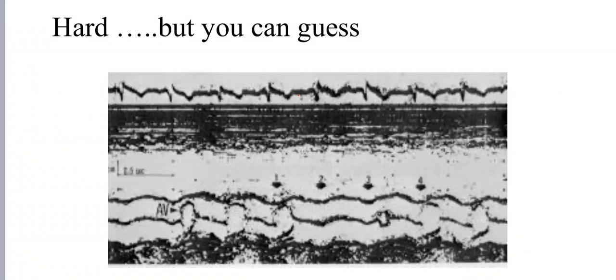So you see this one? Look here. There is supposed to be a beat here, which is lost. And this one is a very small opening. And then I get a better one, and then a better one, and back again. So what can cause this? Aortic membrane? No, an aortic membrane will not lead to that.